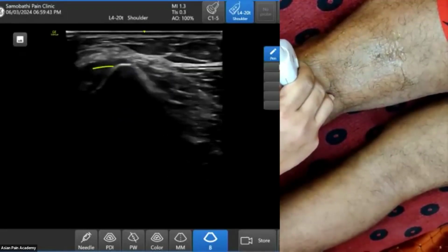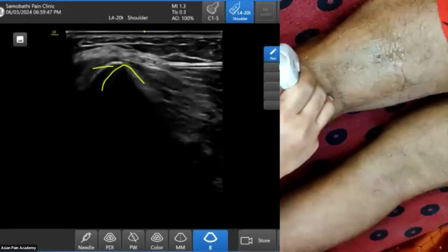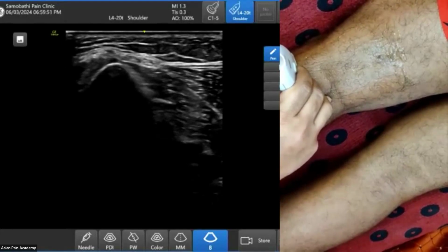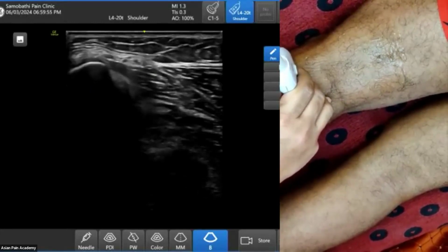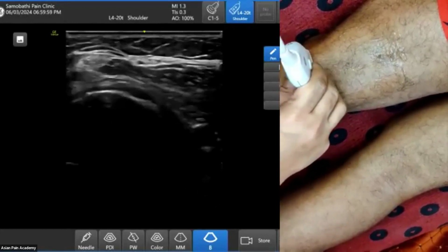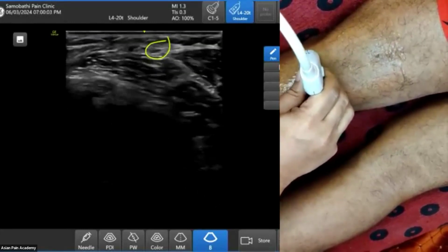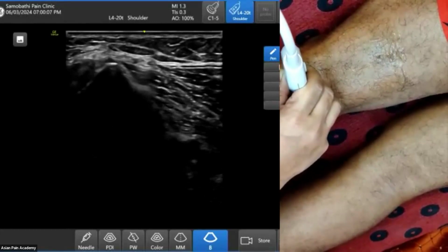Now it is the fibula. Fibula is like this type of thin hilly architecture. So this is just around the fibula. This is the common peroneal nerve. This is fibula just above that. Yeah, under the yellow mark. Under the yellow mark, if I go again, it will become the nerve. Okay, again it becomes the nerve, and it is coming around the neck of the fibula.